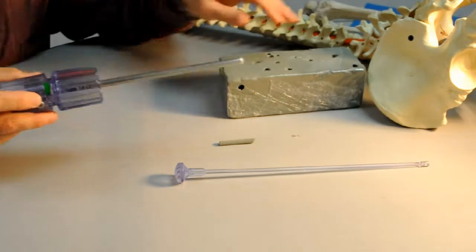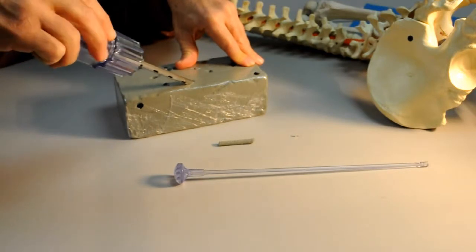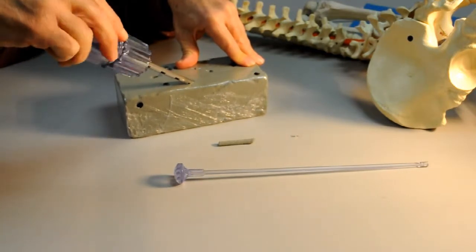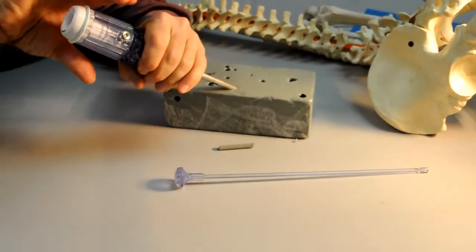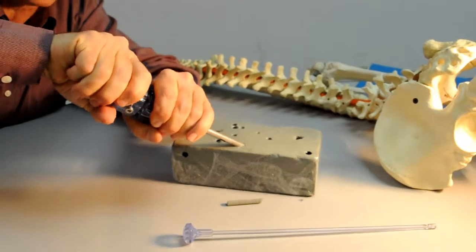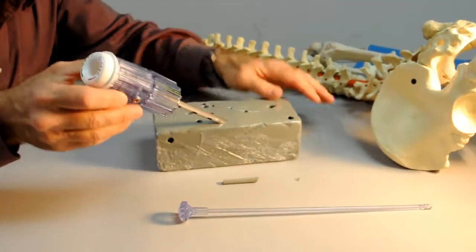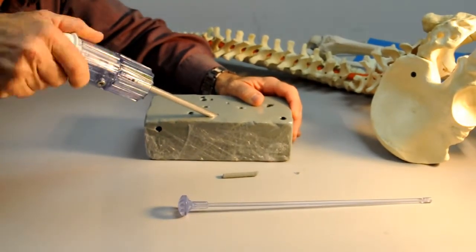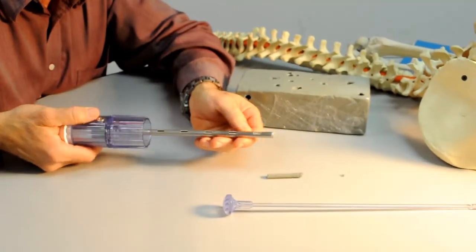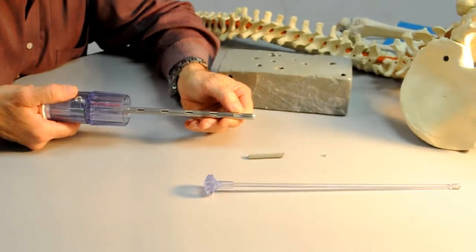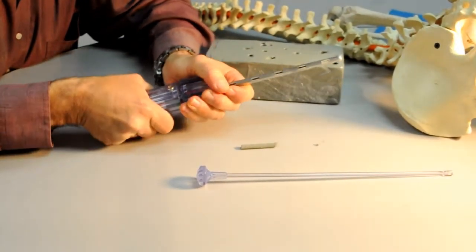We can go through the exact same hole in a different direction, oscillating as we advance the device back and forth, stabilizing the lower segment of the handle, rotating the upper segment to a locked, fully closed position and then extracting by rotating clockwise while we pull the handle out of the cancellous bone. We can again see the cancellous bone in the lower fenestration of the device's shaft.